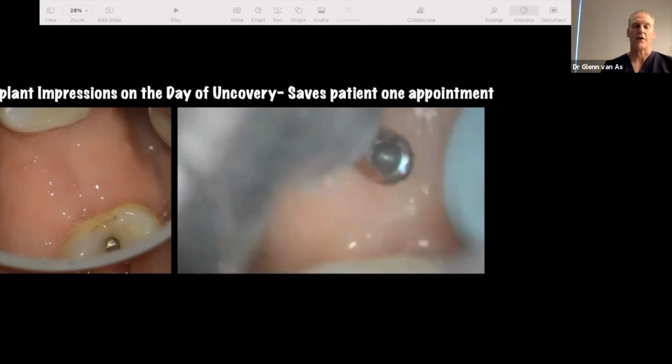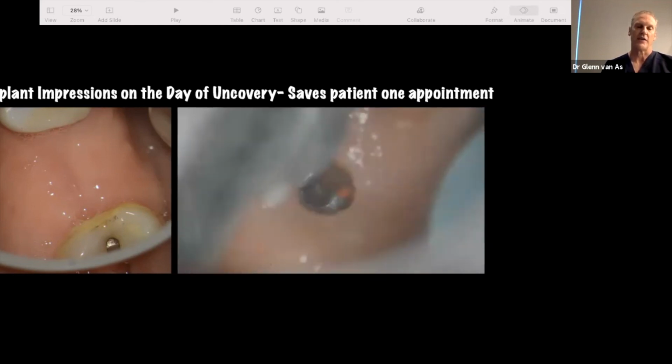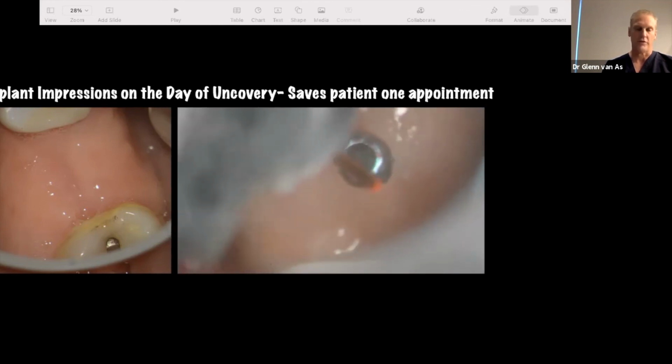We're able to remove that off of there and not worry about thermal because of the water. Look at all the water here. If you're using a diode, stop every 20 seconds. Wet the tissue because the heat can build up heavily. And if you're using a CO2 laser, I'd strongly encourage you to be careful.